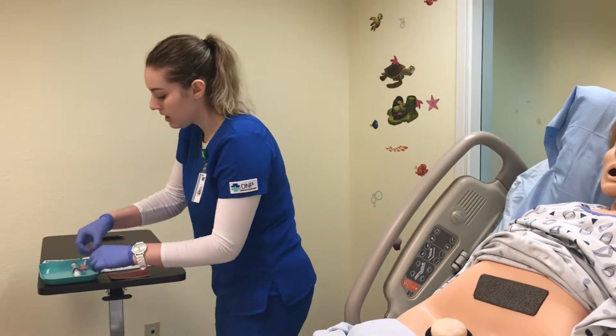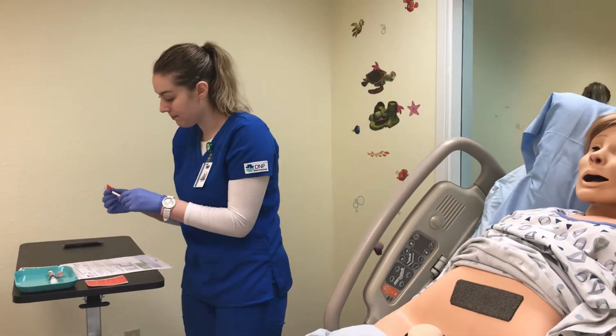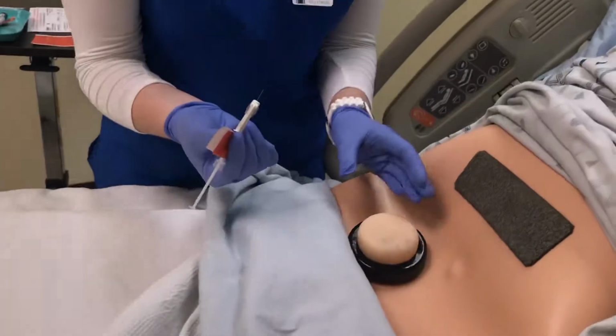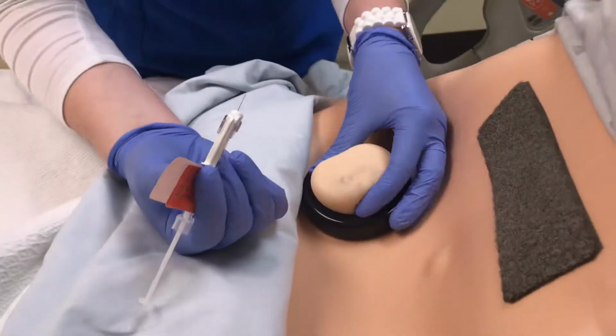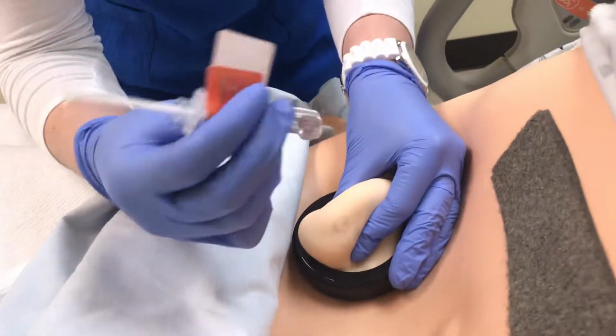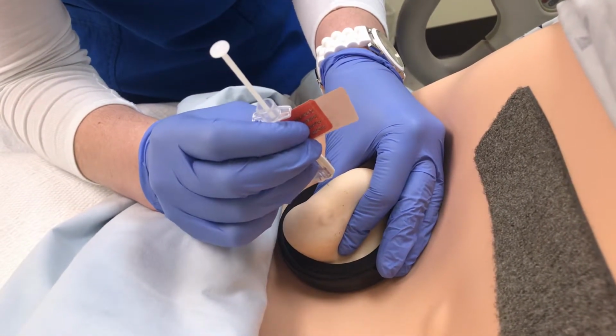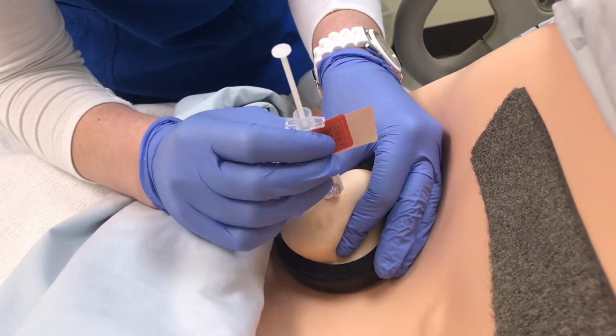So I'm going to grab my needle and decap it. And then I'm going to pinch the skin. So her skin is dry from cleaning it. So I'm just going to pinch the skin. And I'm going to go at a 90-degree angle. Okay, Shirley, on the count of 3, I'm going to put the needle in, okay? 1, 2, 3. Good.